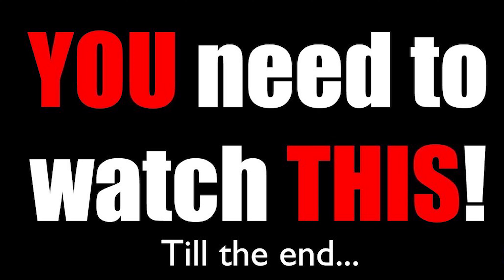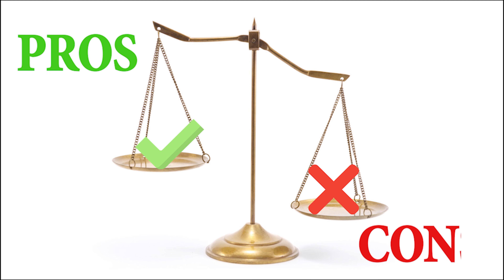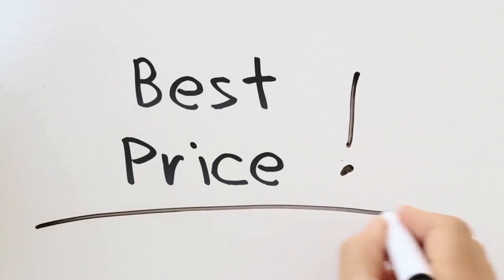Please make sure you watch this entire video as I'm going to go into the pros and cons of this device, and at the end of the video, if you still want to get the Waterpik Sonic Fusion, I'll show you where to get it and for the absolute best possible price.